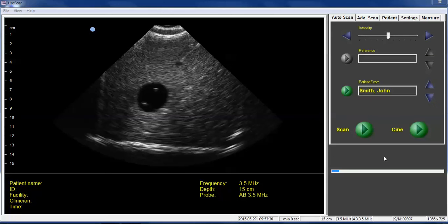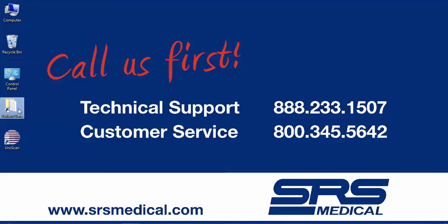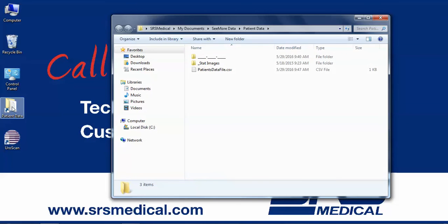Customers would ask me where the patient data is stored on the system here. So that's actually out of the software here. It's very simple. You'll just close it here. And we'll go over to the patient data folder that's located on your desktop. Click on that and you will see the patients listed in here, if there are any, with exams performed. If you have patients entered but no exams under that patient, they won't be listed here.